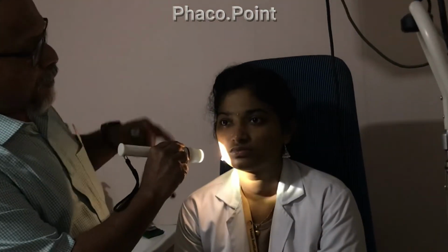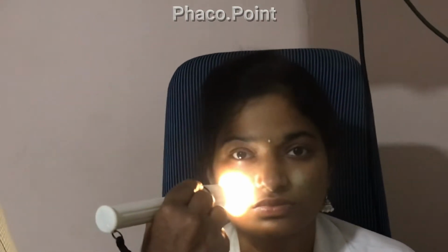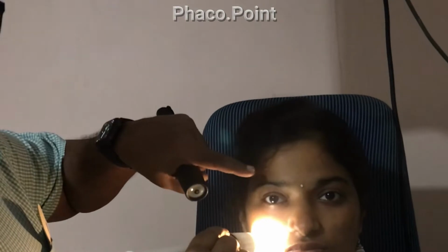Then you shine the light. This is the beam of light. You can see it on the patient's cheek. Make sure that this beam of light falls only on the right pupil.